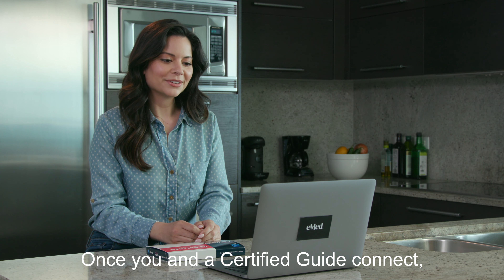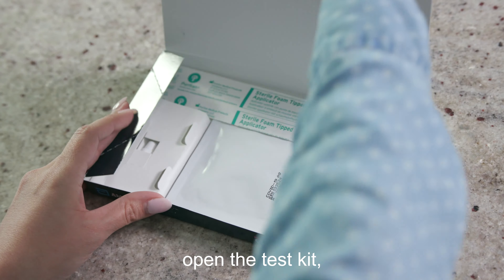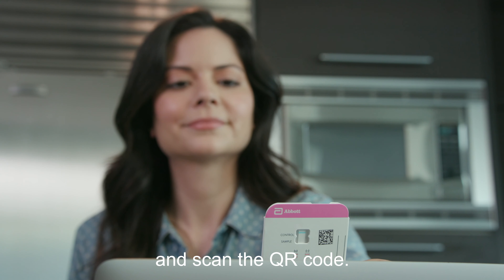Once you and a certified guide connect, open the test kit, show the certified guide the card, and scan the QR code.